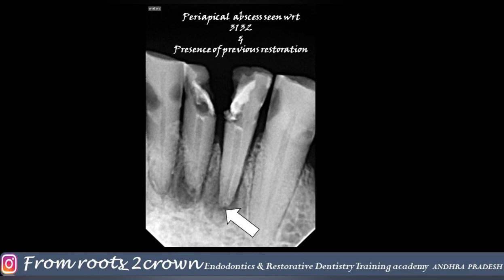On day one, we gave local anesthesia and regained access with the help of a small round bur, and we removed the entire previous restoration material and did cleaning and shaping for both teeth. We placed Calcicure from Endo company, a water soluble calcium hydroxide intracanal medicament, and we advised the patient to recall after 1 week.